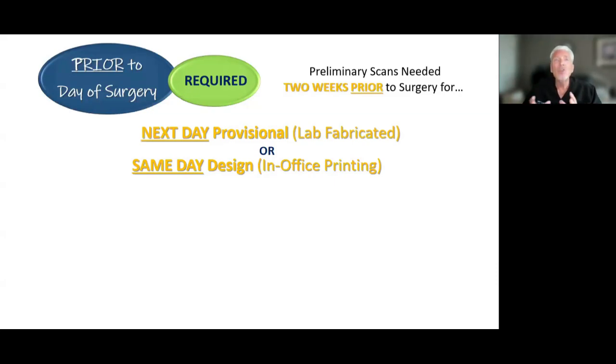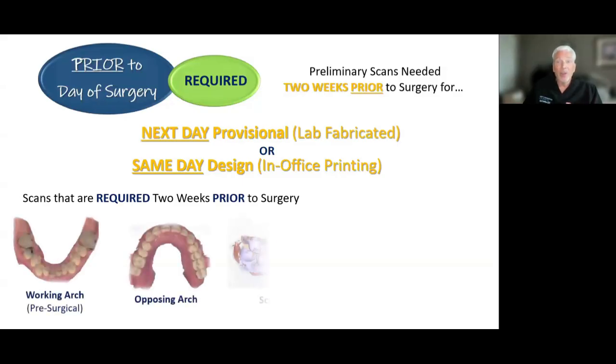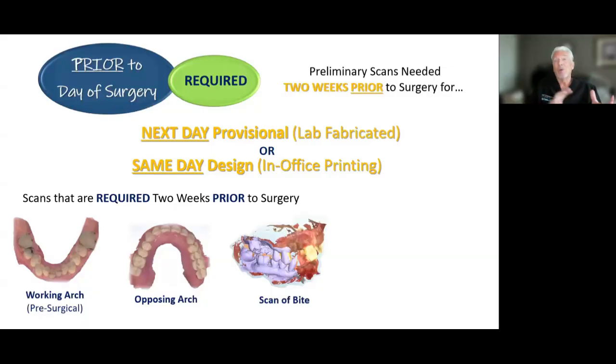Is it 7? What do you need from me technically, clinically, records, and when do you need it by, so that we can do what I'm about to share with you? I can tell you this is what pretty much all the labs are going to need prior to your surgery date. What they do is pre-design your provisional, and they wait for the day of surgery to get the scans of it.